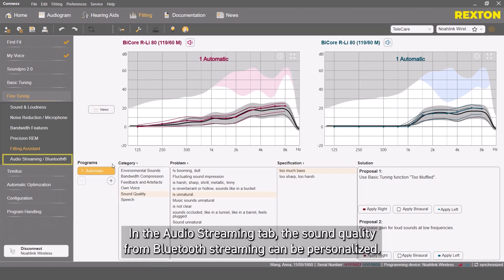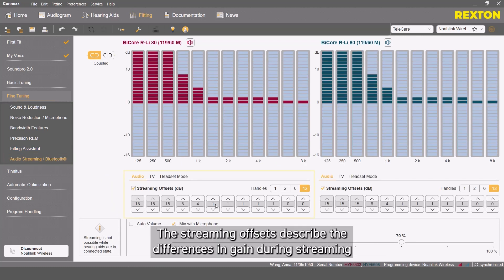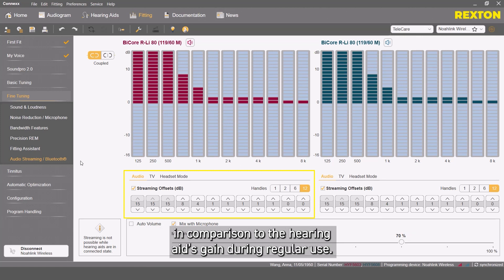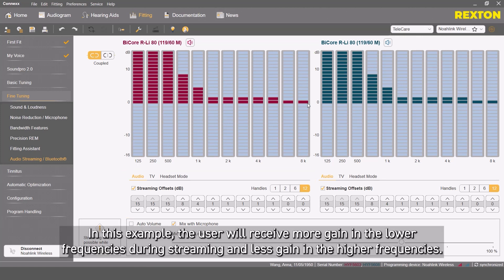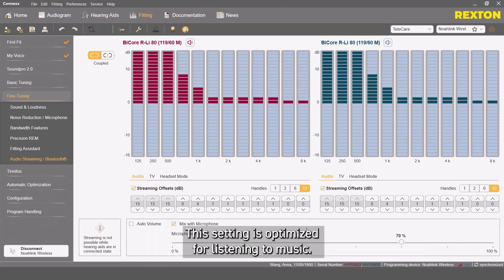In the Audio Streaming tab, the sound quality from Bluetooth streaming can be personalized. The streaming offset describes the differences in gain during streaming in comparison to the hearing aids' gain during regular use. In this example, the user will receive more gain in the lower frequencies during streaming and less gain in the higher frequencies. This setting is optimized for listening to music.